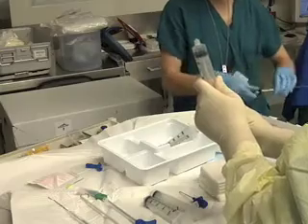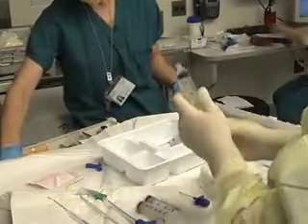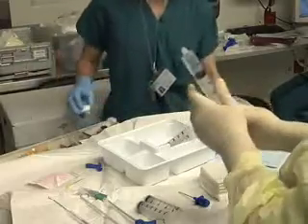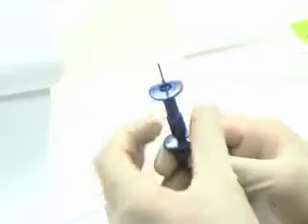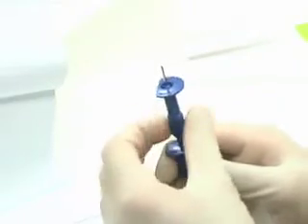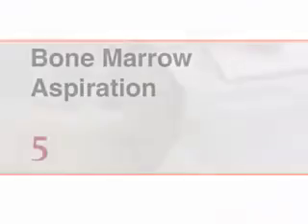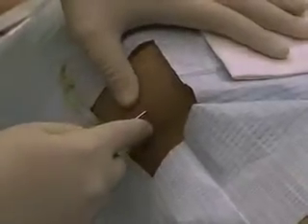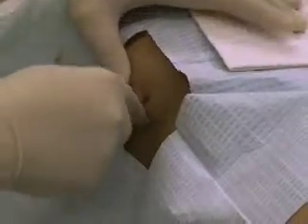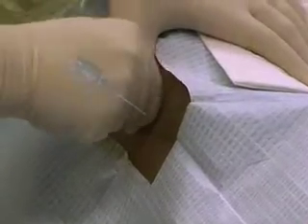Be sure that you have prepared the appropriate number of 30 milliliter syringes with and without heparin prior to starting the bone marrow aspiration. Inspect the bone marrow aspiration needle and remove the plastic guard if one is present. Hold the needle horizontally and insert it into the skin over the posterior iliac crest. Advance the needle until it contacts bone.